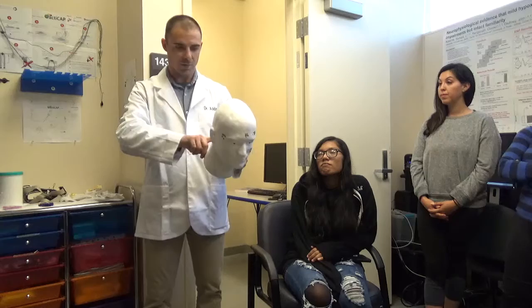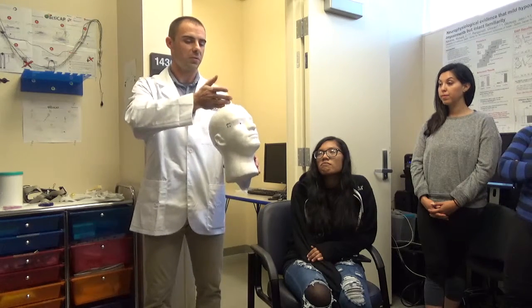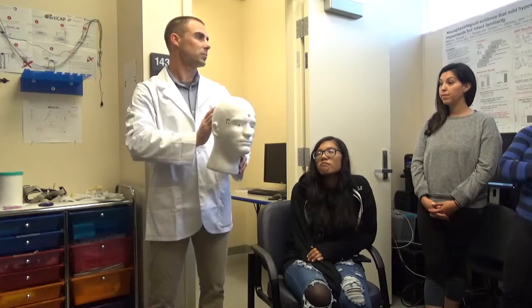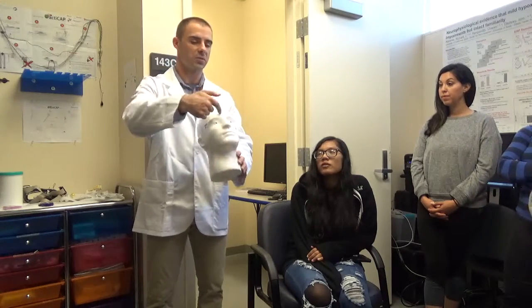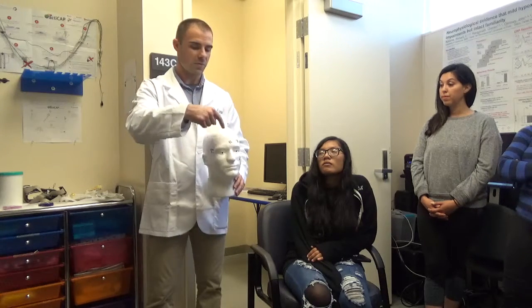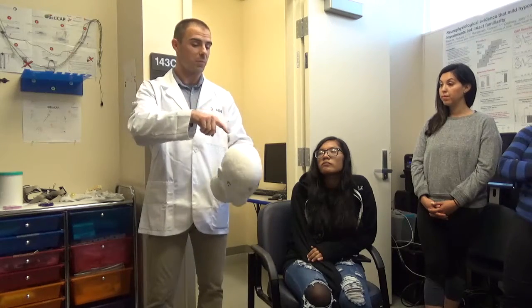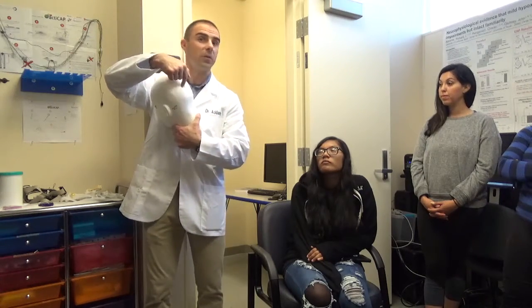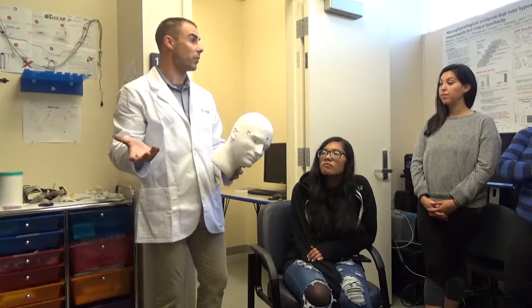And our midline is essentially our 0 number. Now, how do you have a number 0 go all the way across the midline? Because there are different spots. So we label our electrodes. Some are frontal, some are central, some are parietal, and some are all the way back here, occipital. Now, you guys remember those lobes of the brain? Mm-hmm. So it makes a lot of sense that we label them that way, right?